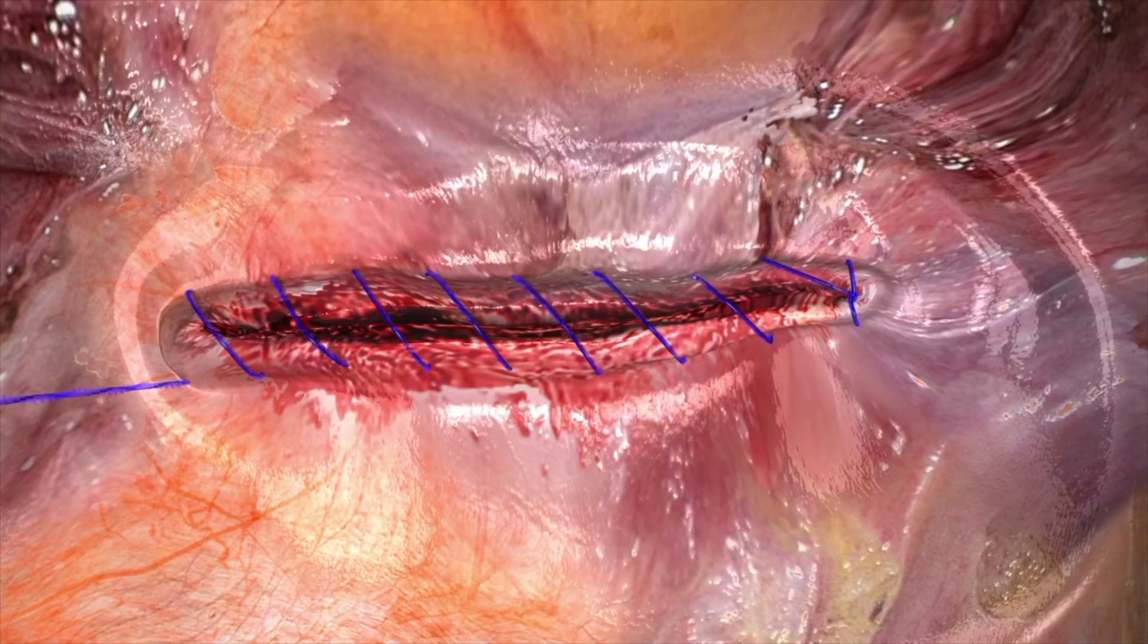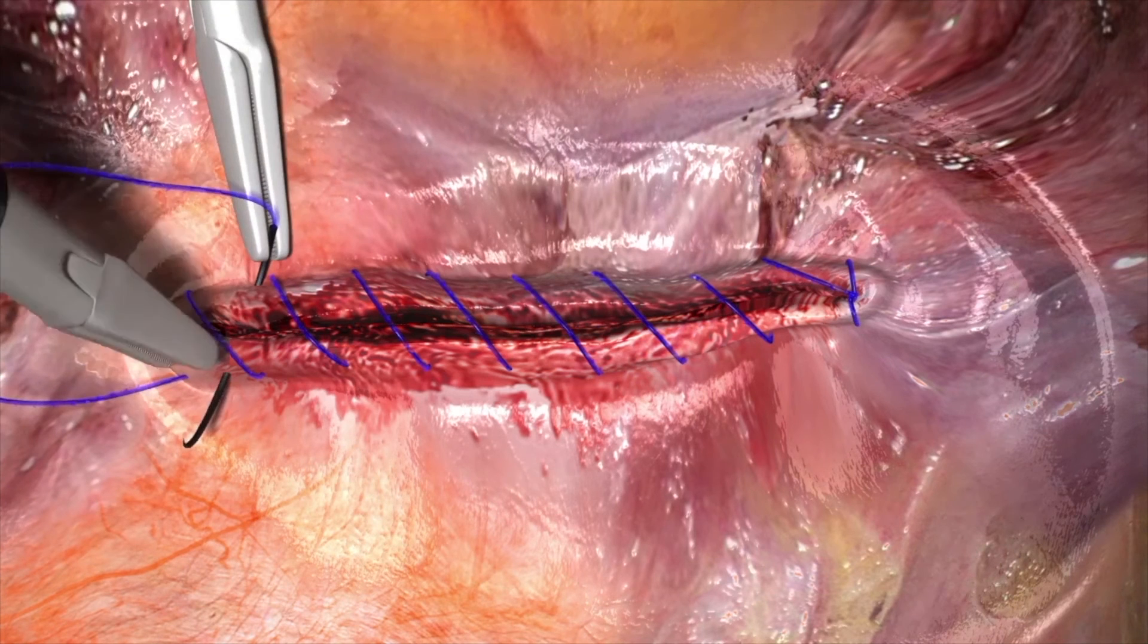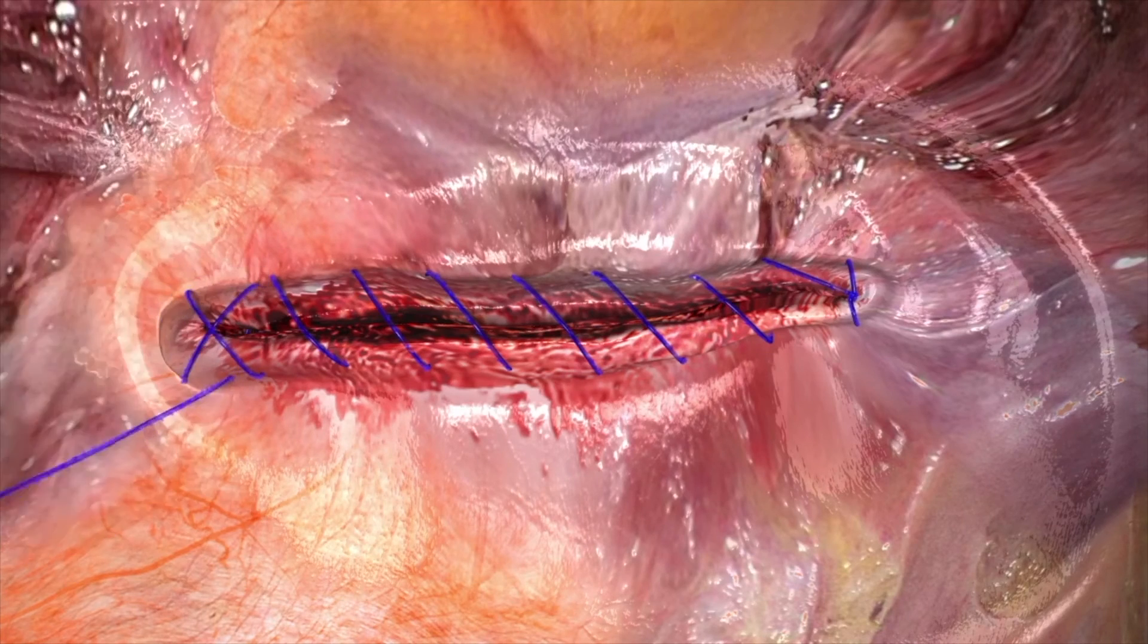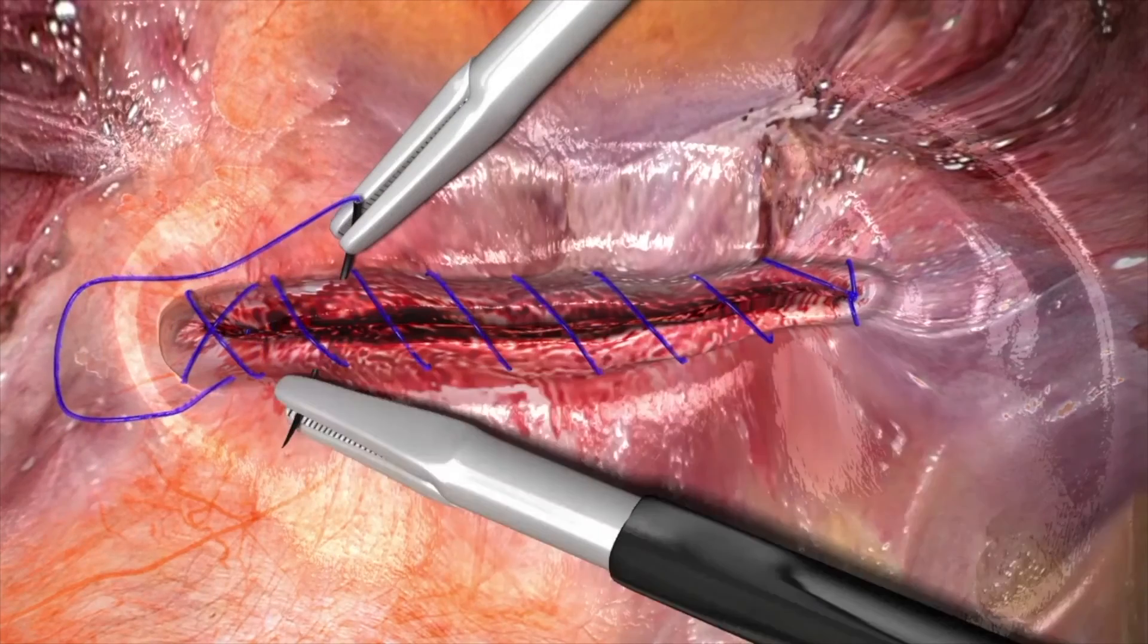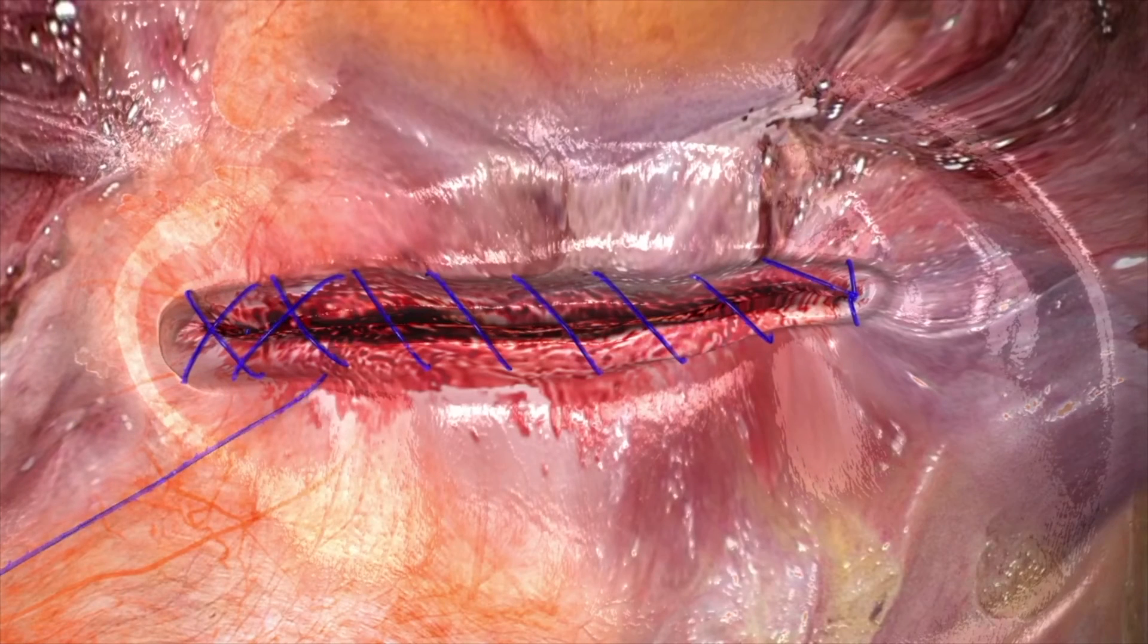Retain approximately three inches, or eight centimeters, of the device for completing the closure and locking down the Stratafix Spiral Devices. To complete the closure, take at least two passes in the reverse direction. This eliminates the need for intracorporeal knot tying. Gently pull on the free end of the device and cut flush with the surface of the tissue. The remaining device and needle are removed.